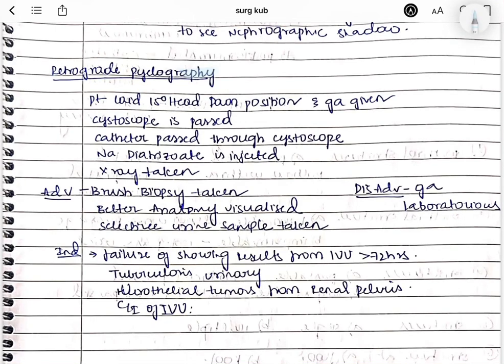In this video, we'll talk about retrograde pyelography. Here, the patient is made to lie in the 15 degrees head down position and general anesthesia is given. So, after giving the general anesthesia, we'll pass the cystoscope, and through the cystoscope, we'll pass the catheter.